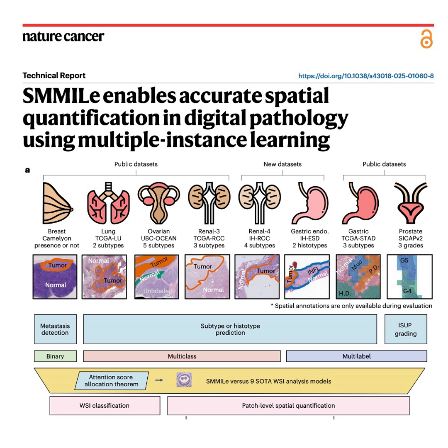And it wasn't just finding hidden cancer, it was categorizing it better too, right? Look in the gastric cancer case. Exactly. This was a subtyping disagreement. SMMILe classified a specific patch as a mucinous tumor subtype, but the human ground truth had explicitly labeled it highly differentiated, which is a distinct, separate category. So what happened upon expert review? It turned out that patch was sitting in a transitional zone between 2 tumor areas. It was a biological gray area, but under intense scrutiny, it clearly displayed a mucinous pattern. Once again, SMMILe's map is more accurate than the original human label.